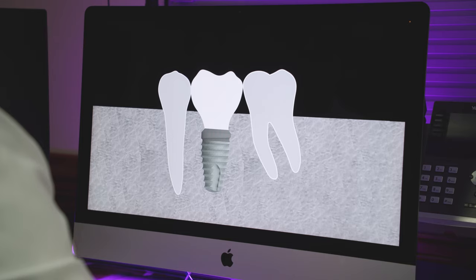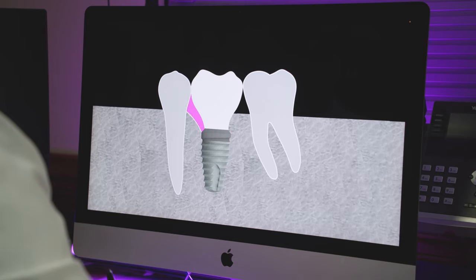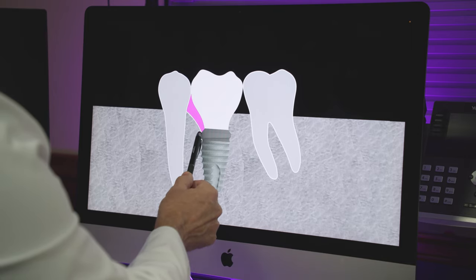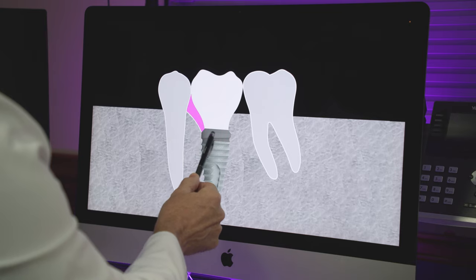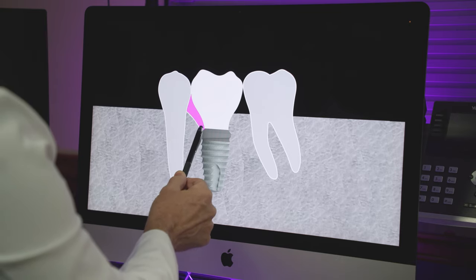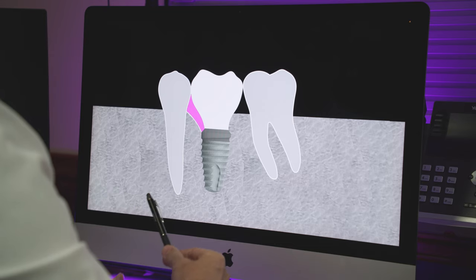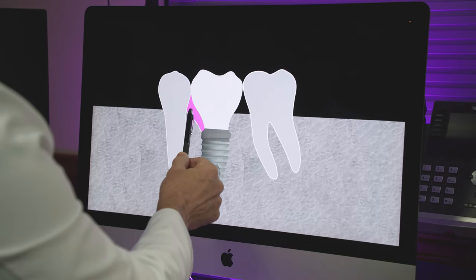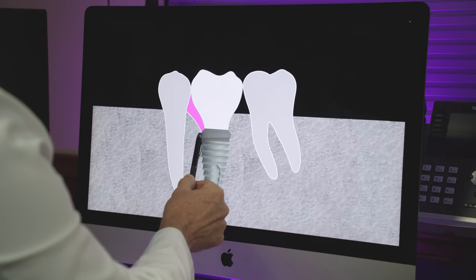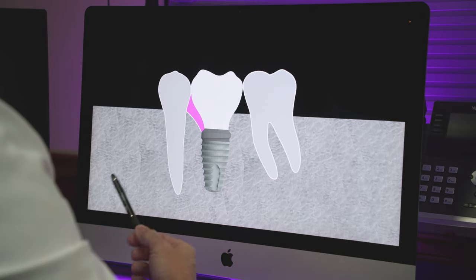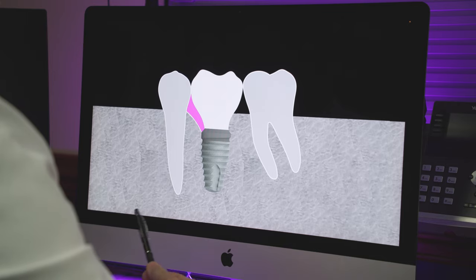Ideally, you would see something like this — but we don't see this. What we see is a little bit of soft tissue that has to grow around the implant interface. On the left, what I've shown is from a platform-switched implant, so the implant's platform is a little bit more narrow than the implant itself — that's called platform-switched. Notice that the pink, which represents the combination of connective tissue and epithelium in this video, comes down and attaches a little bit below the platform level — let's call it 500 microns or half a millimeter.